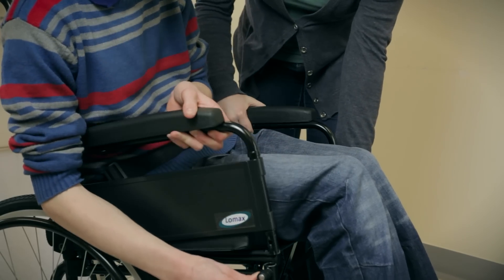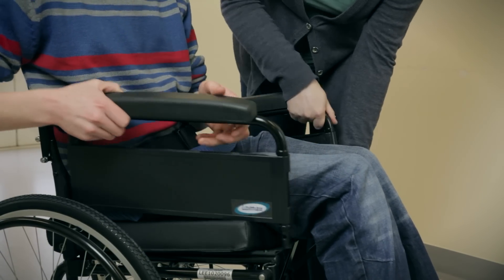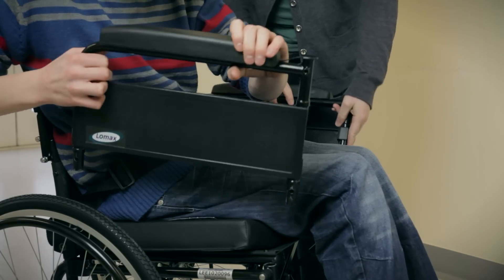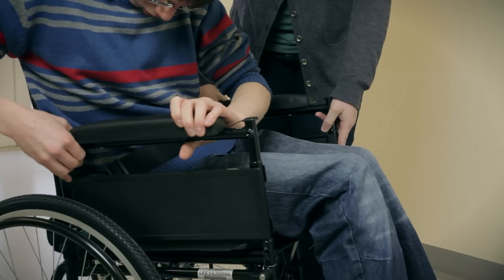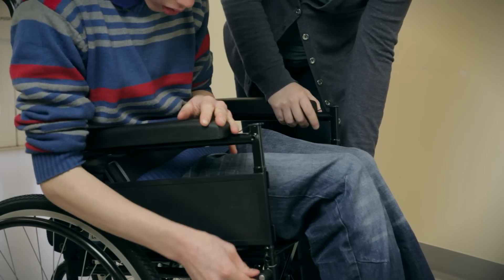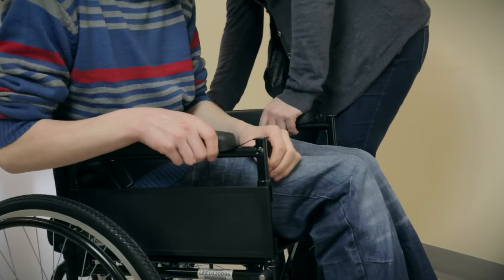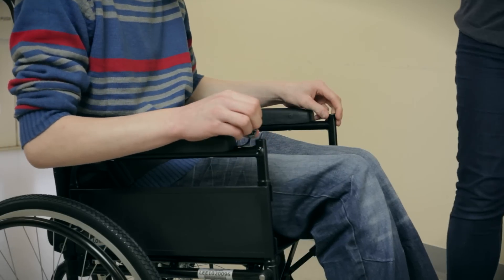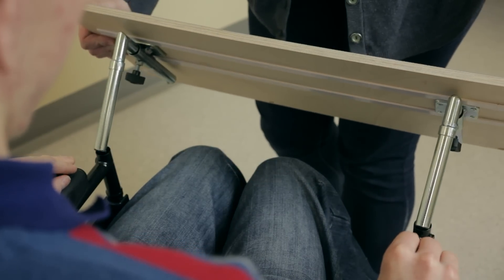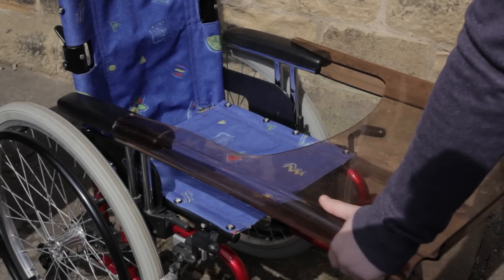A tray can often be fitted to the armrests. These are provided to improve posture or to assist with feeding. Often a tray can be fitted by reversing the armrests and swapping them from one side to the other, as you can see here. If this isn't possible with your chair, then an extra bracket might be available. Or some trays just slide over the armrests.